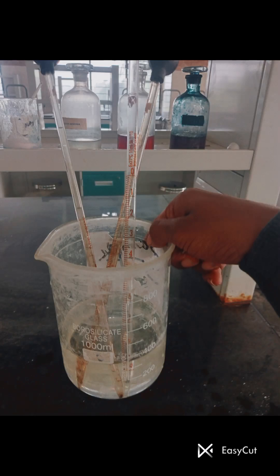Hello everyone. Today I will show you how to perform the Hair Sulfur Test. This test is used for the detection of bile salts in urine — specifically salts of taurocholic acid and glycocholic acid.